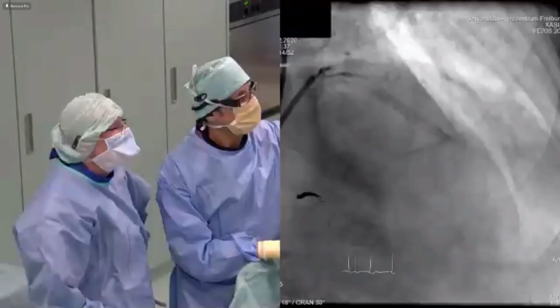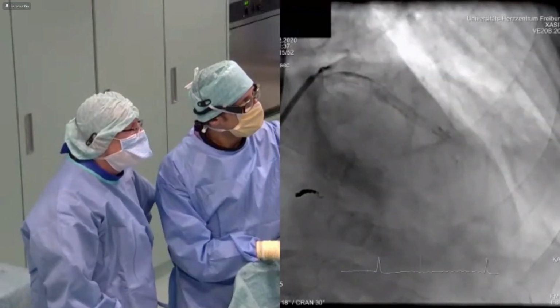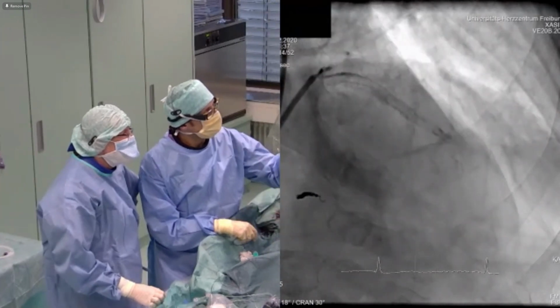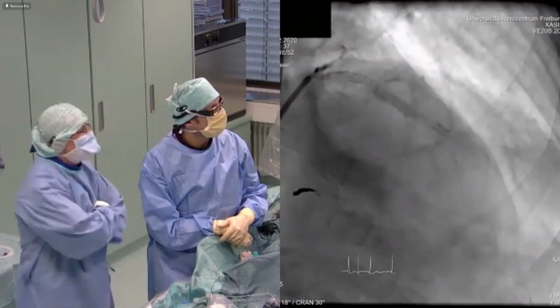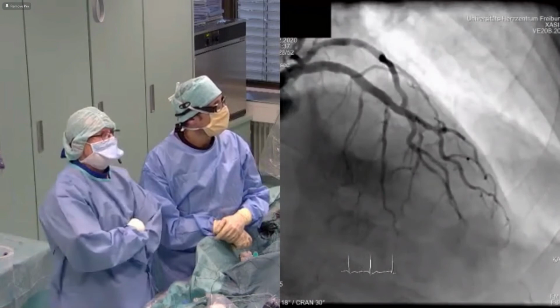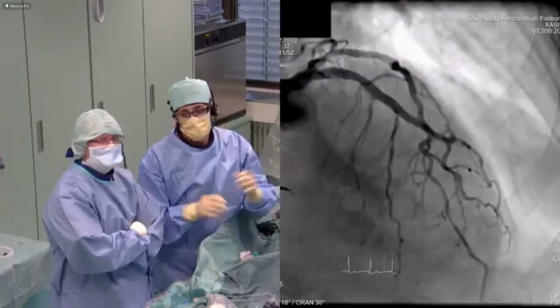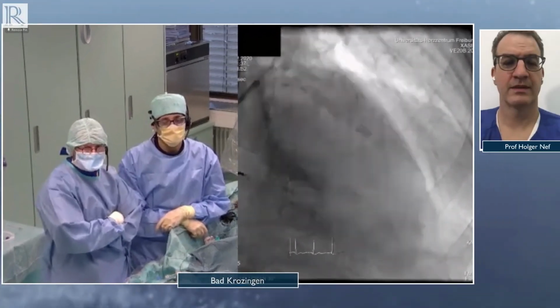Yes, we will. If the patient will still have angina, we will go to where the uptake of the LAD is, and then we will place another IVL there and try to modify the plaque towards the LAD. But I think for 34 minutes today, it's too much. So we will decide to stop here at the moment. And yeah, we are ready for the questions and also for the discussion.